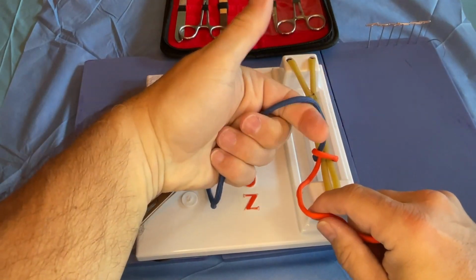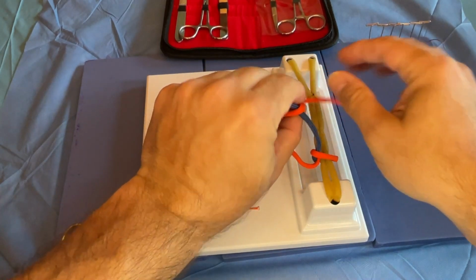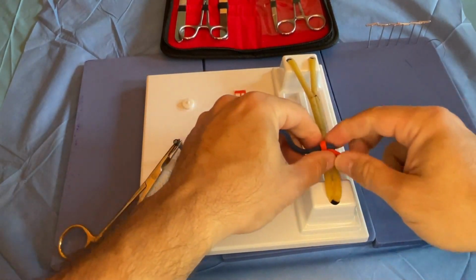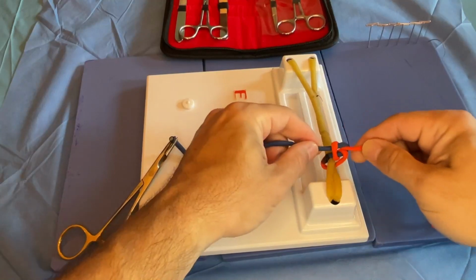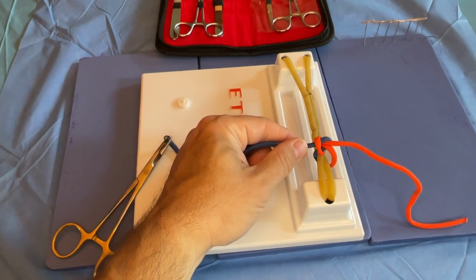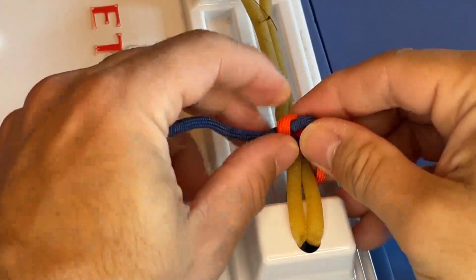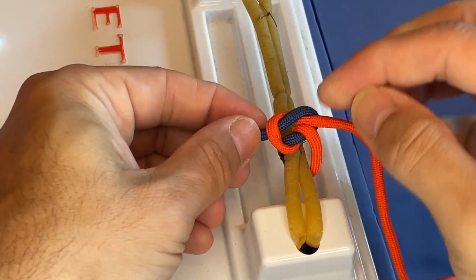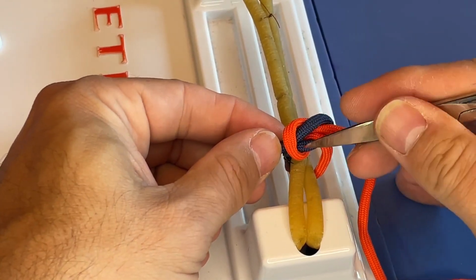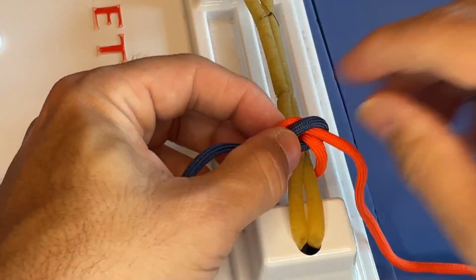And then my next throw is around finger. So loop there, pinch, swing through, grab that free end, swing it through, grab it, and lay that down. And that gives us, if I get that oriented, our nice square knot. So what we're looking for with the square knot is that we've got the two strands here. You can see the two blue strands that are going through that loop of orange, and the two orange strands on this side going through that loop of blue.